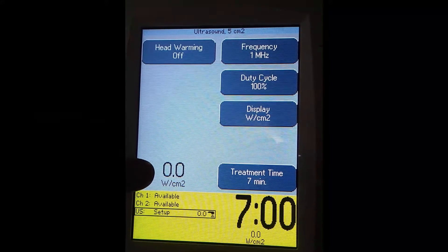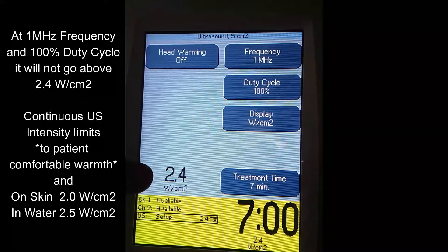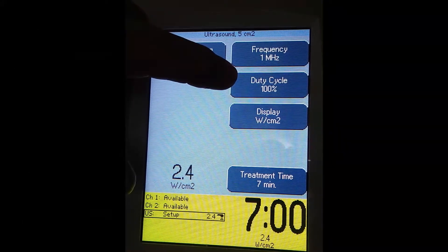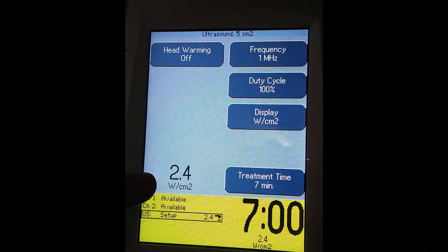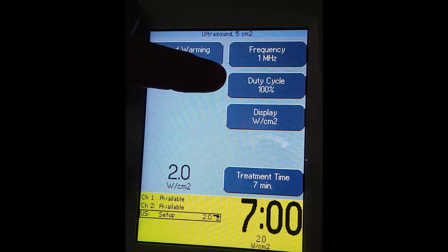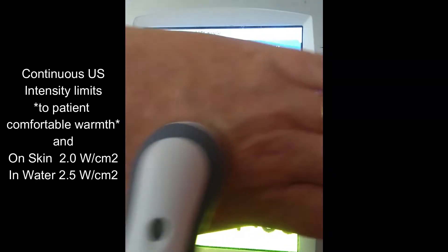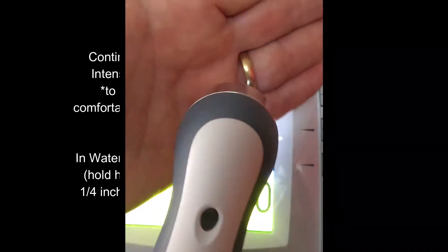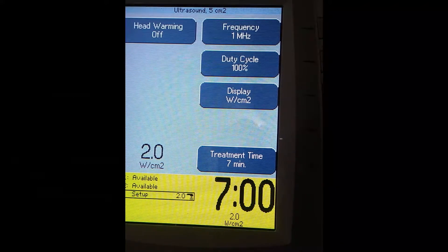Starting at zero intensity, I'm going to turn it all the way up. The maximum it lets you go to is 2.4 watts per centimeter squared. It's recommended that when you use 100% duty cycle causing heat and you're underwater, you don't go higher than 2.5 watts per centimeter squared. This machine is even more careful and limits it to 2.4. However, if you were using continuous 100% duty cycle ultrasound on the skin, you would not want to go above 2.0 watts per centimeter squared. So underwater, where the head is near but not touching, you can go up to 2.5, but don't go above 2.0 on the skin.